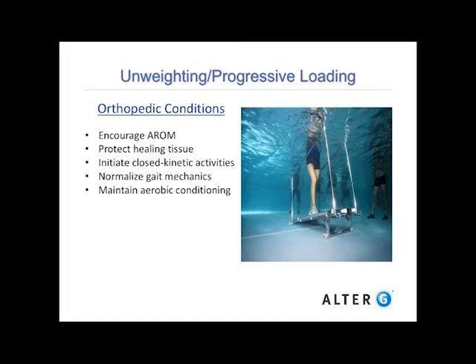So if they're recovering from a stress fracture, Achilles tendonitis, patellar tendonitis, they can still maintain aerobic conditioning even at reduced body weight. So if they're training for a race, they don't have to lose a lot of the conditioning which they developed already. They can maintain it while they're healing, and they can start back up at a higher level.